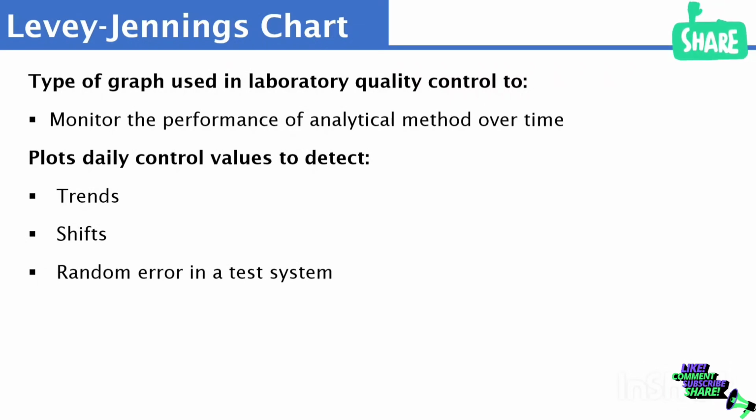Now, let me just say this as a little background. When we talk about these processes, it's not just entirely the analyzer. The analyzer is just one part of the processes that you have to ensure that your system is working correctly. So when you look at your standard operating procedure, the processes involved in carrying out the test, including the sample preparation, how the test should be run, and all of that. Obviously the analyzer, the quality control chart, calibration and all of that, these whole things contribute significantly to how we are able to determine if the process is up to standard or has missed standard.